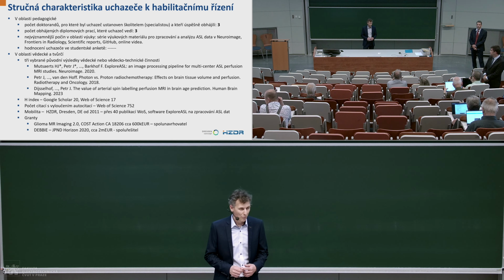Professor Tintiera. Maybe I'd follow. Concerning your contribution, I would say there is also one very important methodological research. This is this partial volume correction, and this is really very nice work. I like it very much. And so I also wanted to ask whether this technique which you developed is generally useful, because the standard technique is to segment morphological data, T1 weighted morphological data, and then to use them to compensate for this partial volume effect.